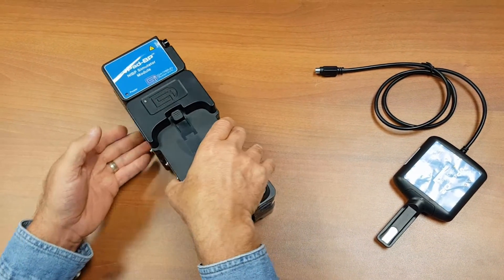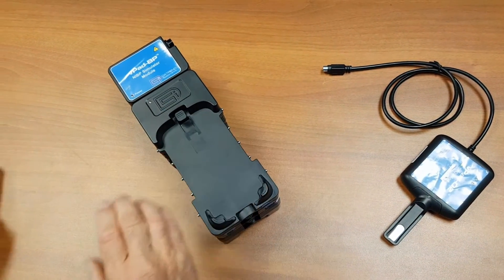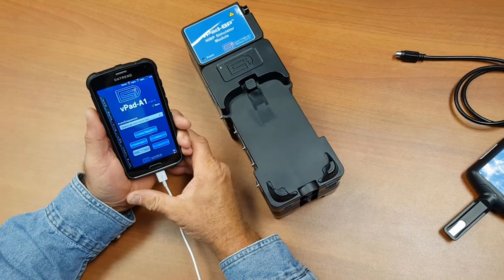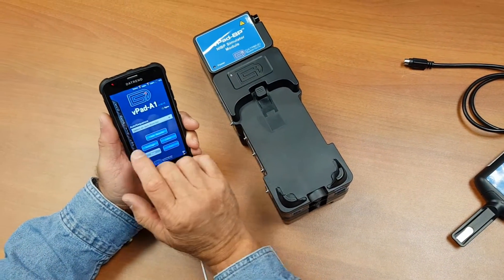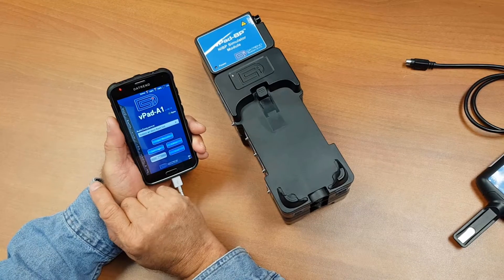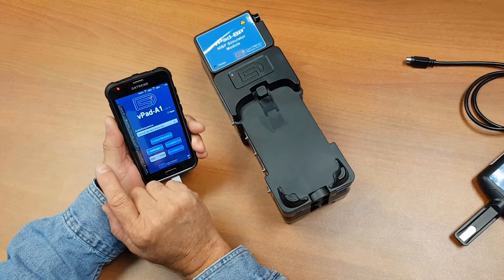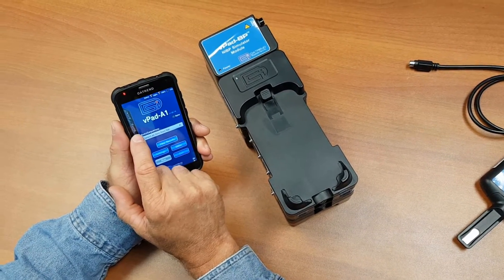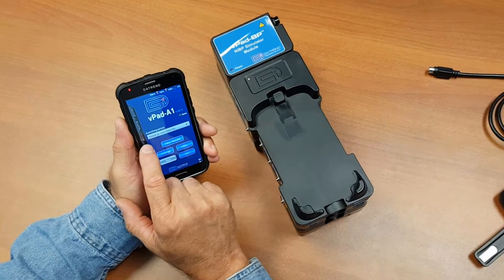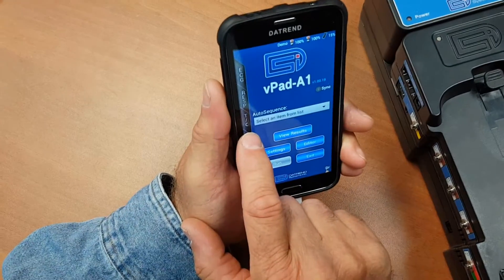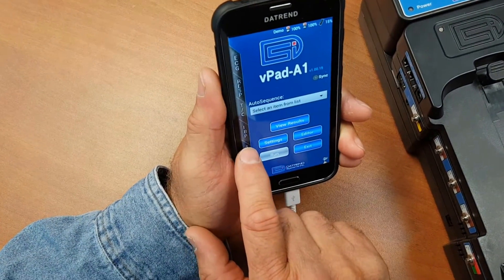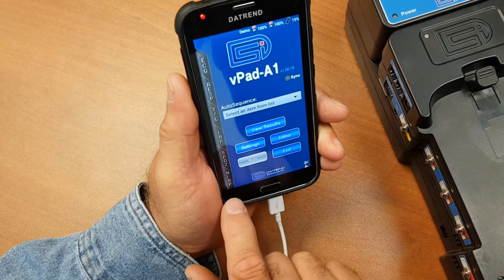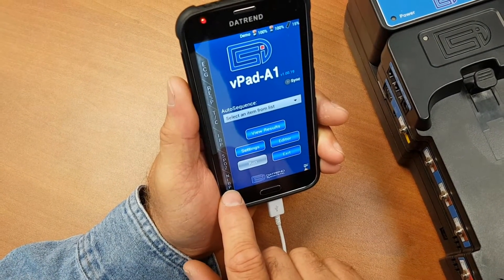When it's in operation, you use the tablet to control the device and can make changes to a number of different parameters: ECG, respiration, temperature and cardiac output, invasive blood pressure, SpO2, and NIBP.